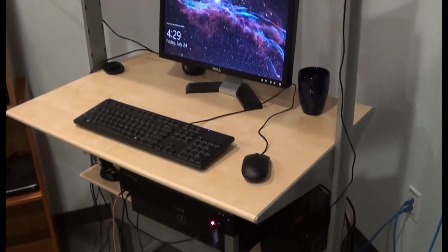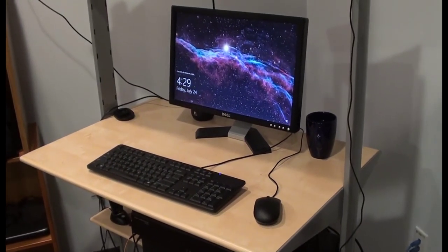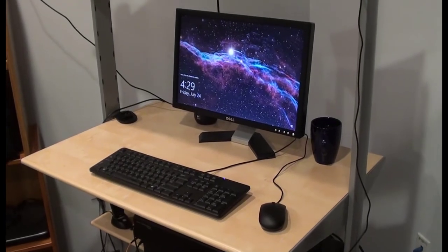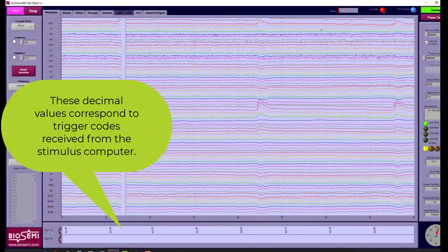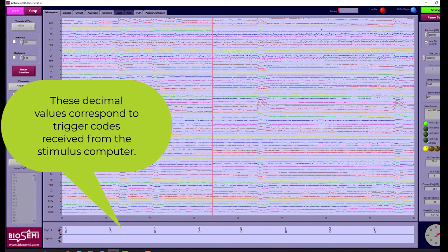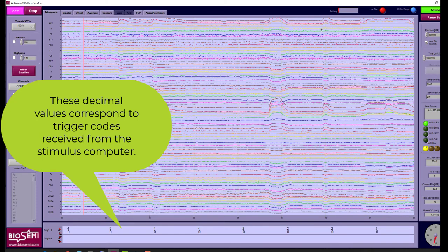Of course, it is a good idea to test your recording computer and confirm that you have the necessary login and that there is free space to store the EEG data. Along these same lines, please consider testing to be sure that triggers are reaching the EEG system before your participant arrives. This is not something you want to do while the participant waits, and it's not something you want to overlook.